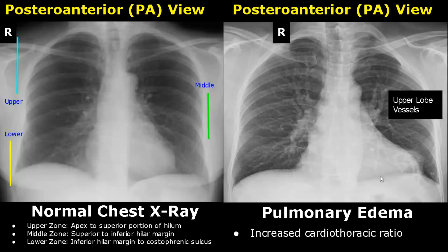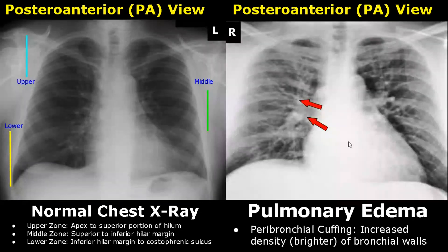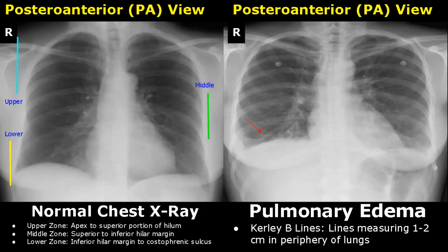Increased cardiothoracic ratio is another feature if there is an association with a cardiac abnormality — you can see an enlarged heart. In peribronchial cuffing, there is increased density of bronchial walls and these walls will appear brighter. You can see the walls of the bronchi are brighter here, whereas in the normal image this is not seen. Kerley lines are a series of bright lines seen at different locations of the lung parenchyma, and they occur due to edema.